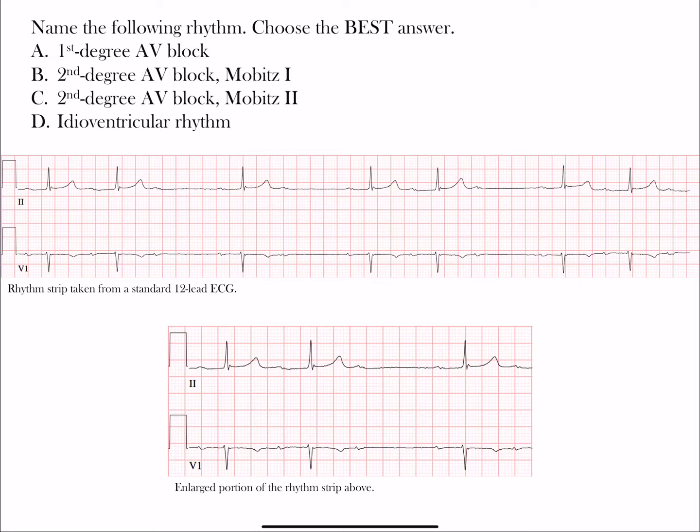Welcome back, here we have another rhythm. Name the following rhythm and choose the best answer. Our choices are: A) first degree AV block, B) second degree AV block Mobitz Type 1 or Wenckebach, C) second degree AV block Mobitz Type 2, or D) idioventricular rhythm. Let's go through these.